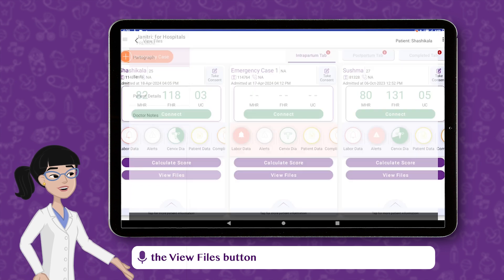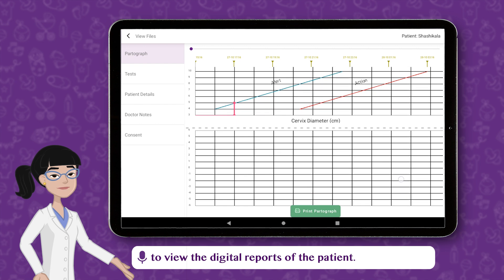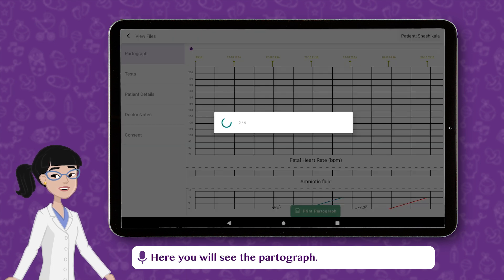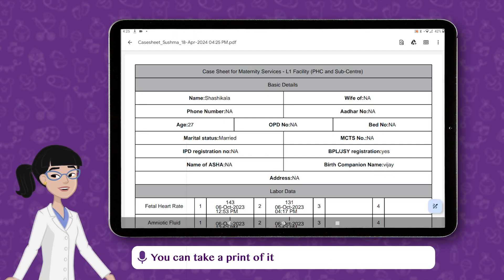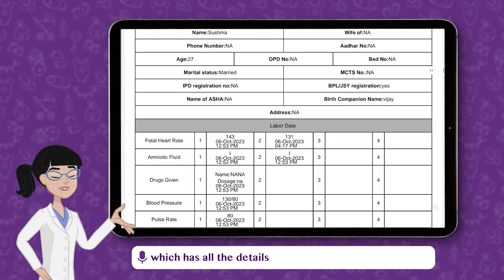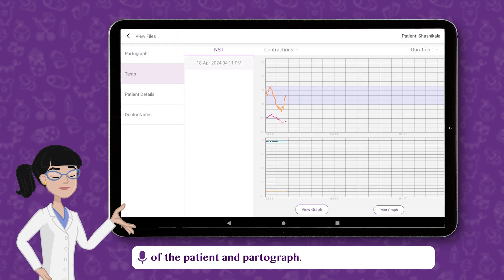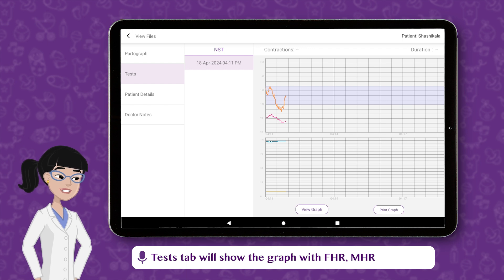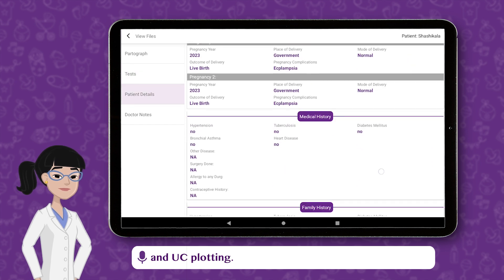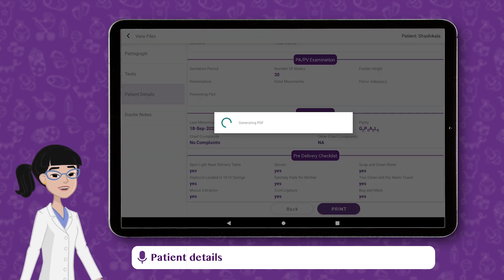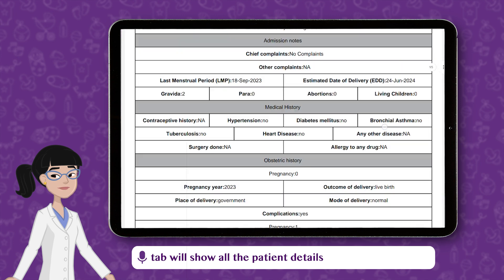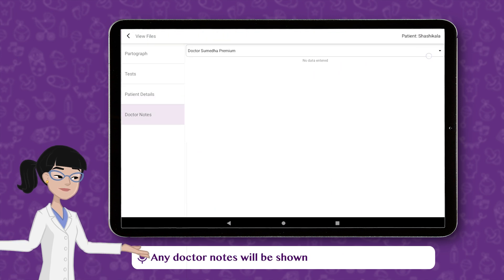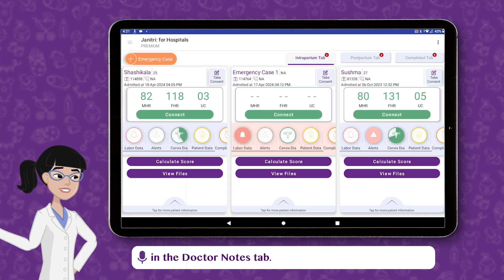Tap on the View Files button to view the digital reports of the patient. Here you will see the partograph. You can take a print of it which has all the details of the patient and partograph. The Tests tab will show the graph with FHR, MHR, and UC plotting. The Patient Details tab will show all the patient details which you can download and take a print. Any doctor notes will be shown in the Doctor Notes tab.